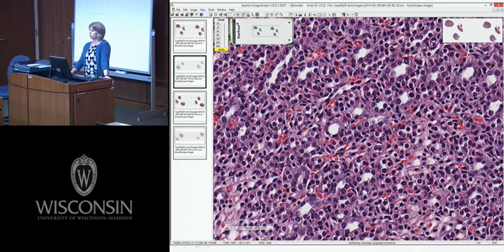The software will allow you to take a snapshot, so you can take a snapshot of this image from that entire slide, and you can send that to an investigator, or you can scan the entire thing and send that. Additionally, you can open multiple images in your toolbar on the side over here.